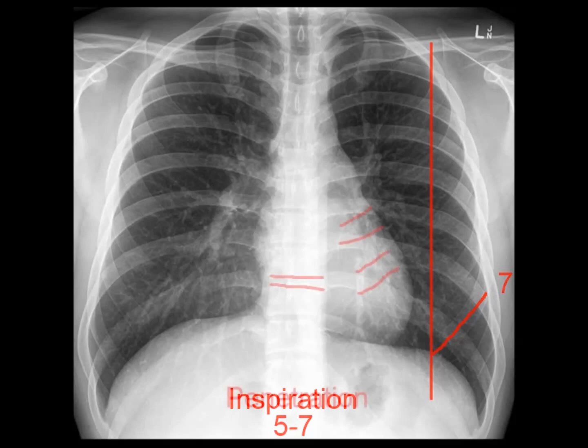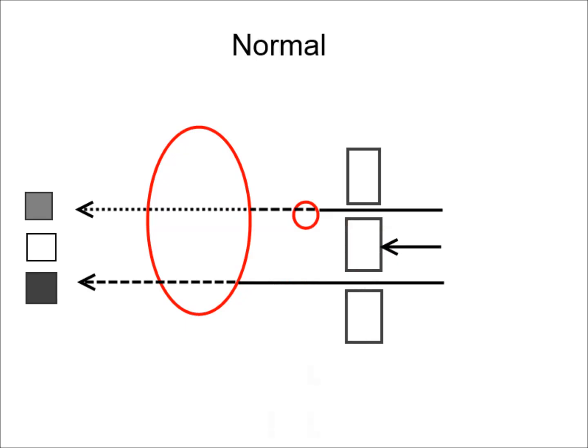Finally, check the penetration of the rays. Simply put, an overpenetrated film is too dark, an underpenetrated one is too white. A trick to judge penetration is to look in the region of the heart. If you can see the spaces between the vertebrae and pulmonary vessels through the heart, penetration is adequate.